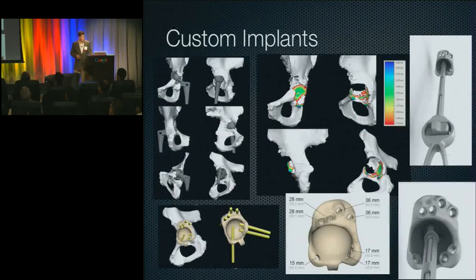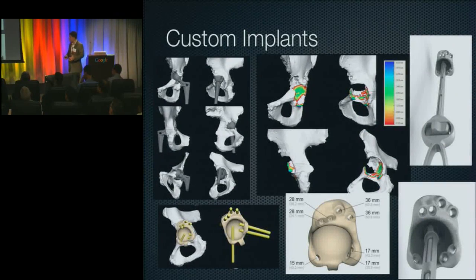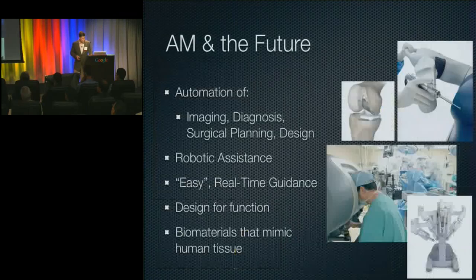So there's a lot of work in metals, and the ability to do that on off-the-shelf components is one thing, but the ability as well to do that on a custom basis is just a great fit for additive manufacturing. We can take a patient with a failed hip prosthesis, design exactly what the surgery needs to be to replace that prosthesis with something that fits better. You can tell the surgeon exactly where to take off bone, and then guide the whole thing through the instrumentation and the screws and the rest of it, all in one place.